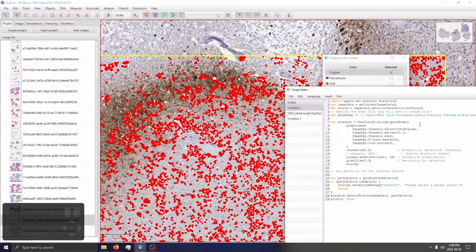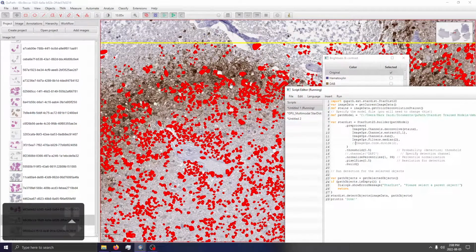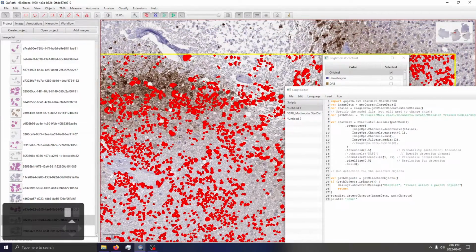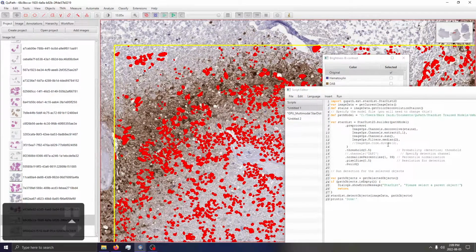I don't believe division will have that big of an impact on model performance because we already perform normalization. If I'm not mistaken, it literally had no impact. If you're dividing by a constant or adding a constant to all values in an image, when you're normalizing it, then it's not going to make any noticeable difference.